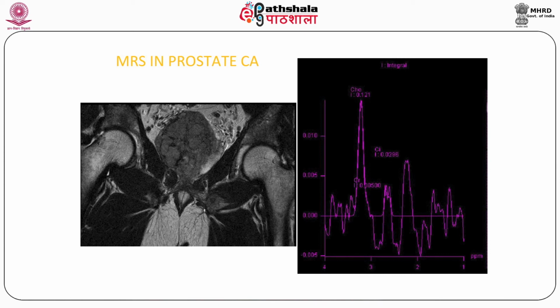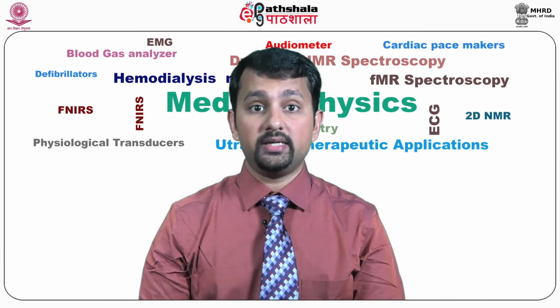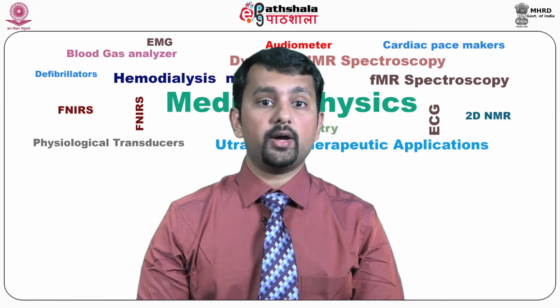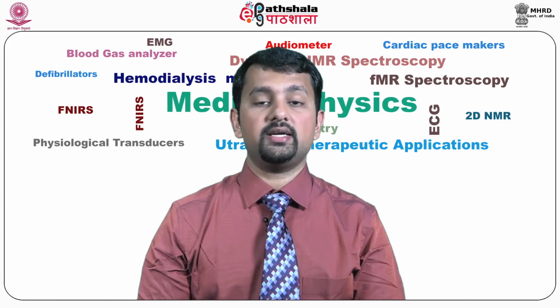What we see in the graphs are a water peak which predominates along with CH2 lipid peaks and CH3 lipid peaks in the various graphs that we have seen here. The newer trends in liver imaging, such as infusion of hyperpolarized carbon-13 labeled substrates into the patient, has the potential to allow fluxes in carbon-13 to be monitored through key metabolic biochemical pathways such as glycolysis, the citric acid cycle and fatty acid synthesis.